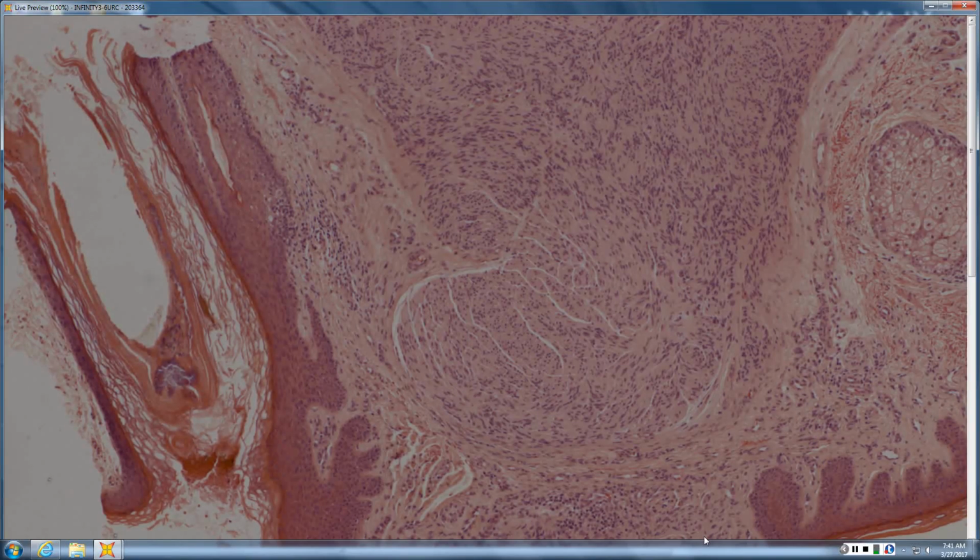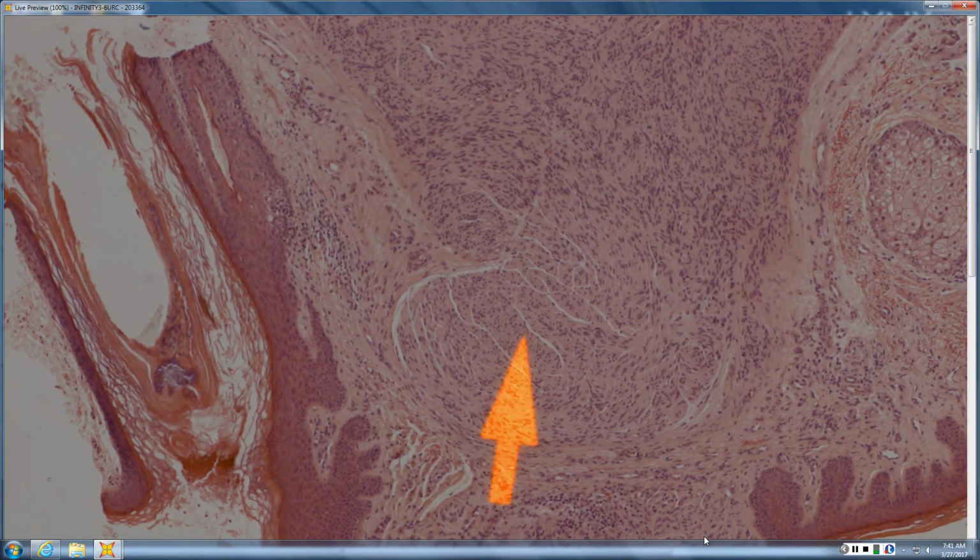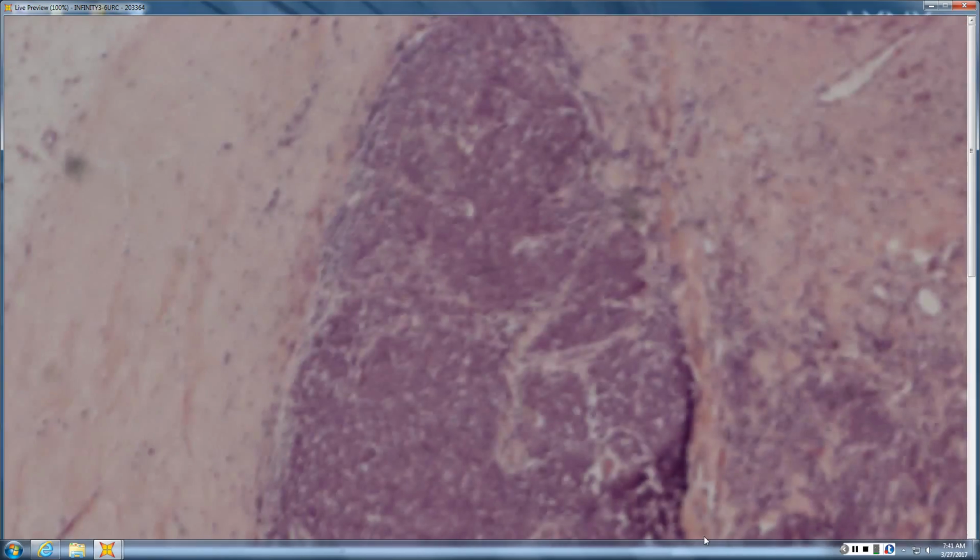Well, a PEN, right? But characteristically, they're vertically oriented, and they're composed of fascicles of nerve separated by clefts. So superficial, fascicle of nerve, separated by clefts. The palisade, the capsule, those things aren't required.